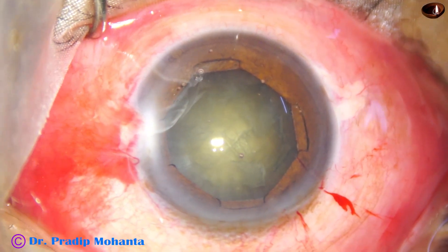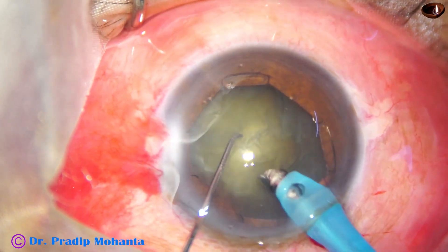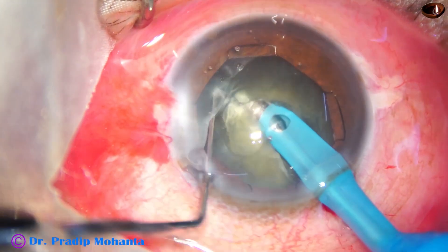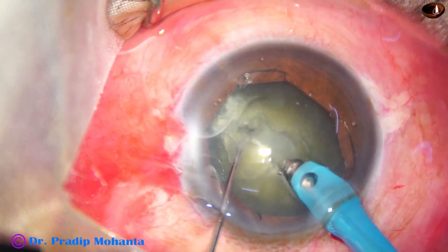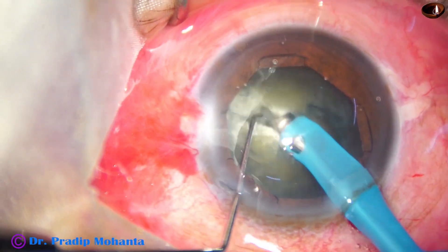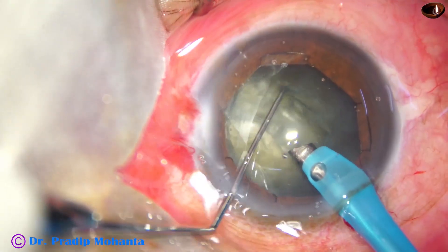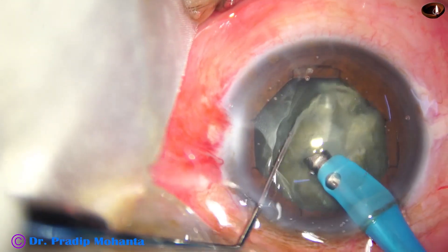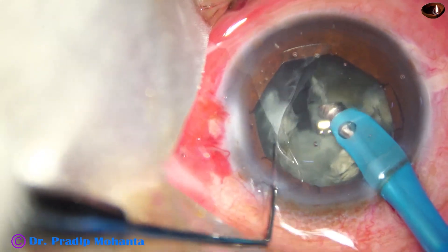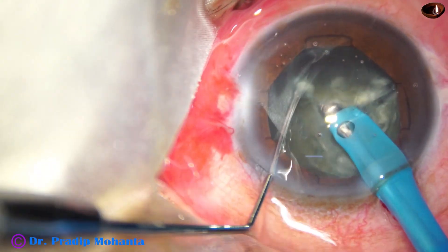I cannot be rough, but I can do manipulations with more courage and confidence. Now I am doing the direct chop. The tip is buried in the substance of the nucleus, a good purchase is achieved, and I try to divide the nucleus — but the crack was not good, so I am holding at another place and trying to get another crack. Rotation is also not quick in cases with weak zonules, as the capsulocortical adhesions are stronger. I have got a nice crack; I rotate it about 90 degrees and get another crack.